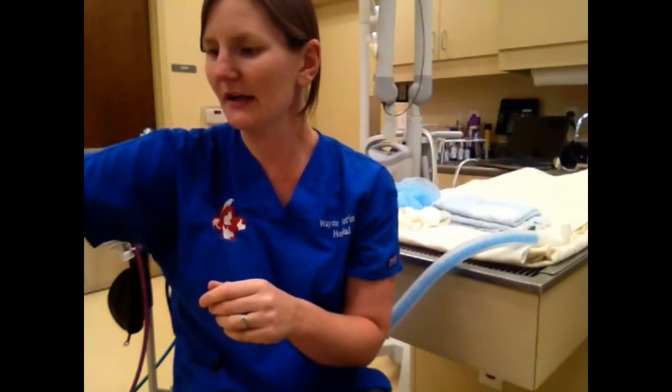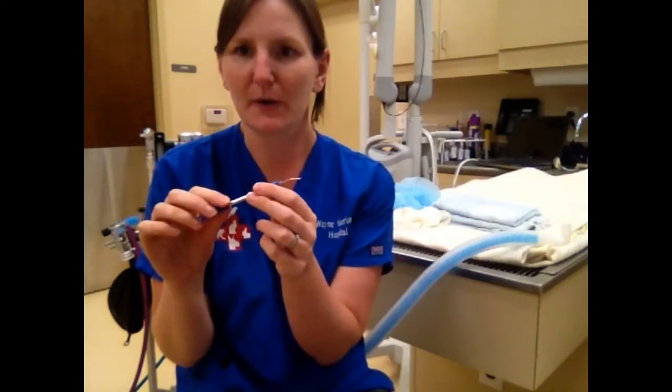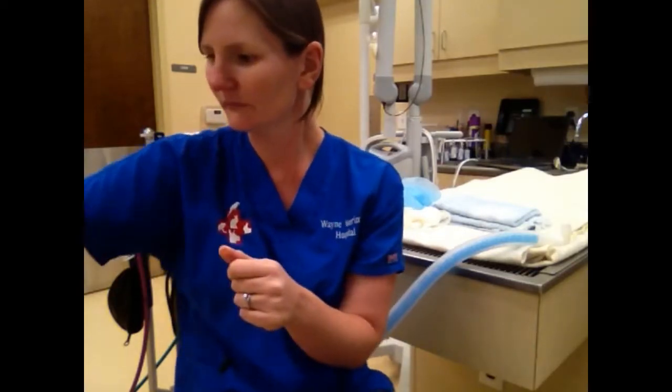We also then finally just have our dental probe, a very important piece of equipment. This is a banded probe, and we use it to check the depth of the pockets between the teeth and the gums. So I think that's all. That's all the instruments that we should be using and needing today.